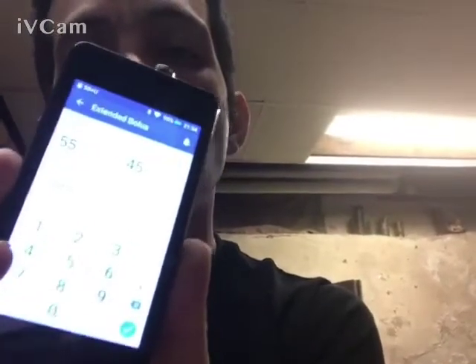Then you have to set the duration that you want that 45% to come in over. Normally for pizza, I put it for two and a half to three hours, because that's about as long as it takes.